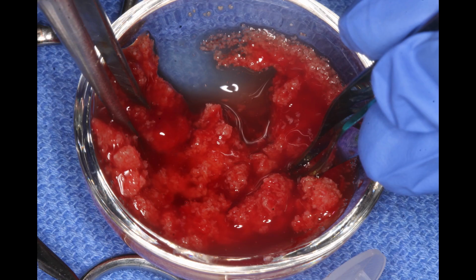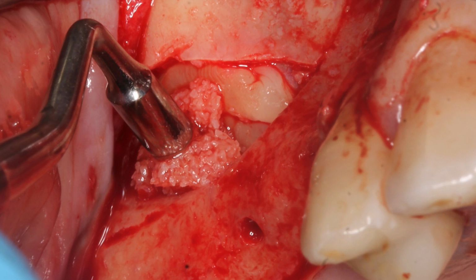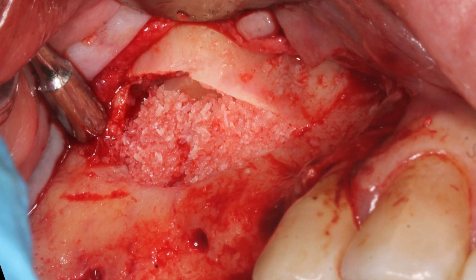This is the sticky bone that's in preparation. And the sticky bone, of course, is clumped together, make sure it's well set, and I'm separating it into little pieces so that we can pack, and we use a standard amalgam pack-alike configuration instrument to pack. You just need to have the right depth and the width and the length so that you can push the bone into the exactly desired position so you don't underpack or have voids within the sinus. And the last thing you want is the membrane to have another sort of indentation somewhere that's not visible. So it's very prudent that we pack this evenly into all directions, keeping this three-dimensional shape in mind.